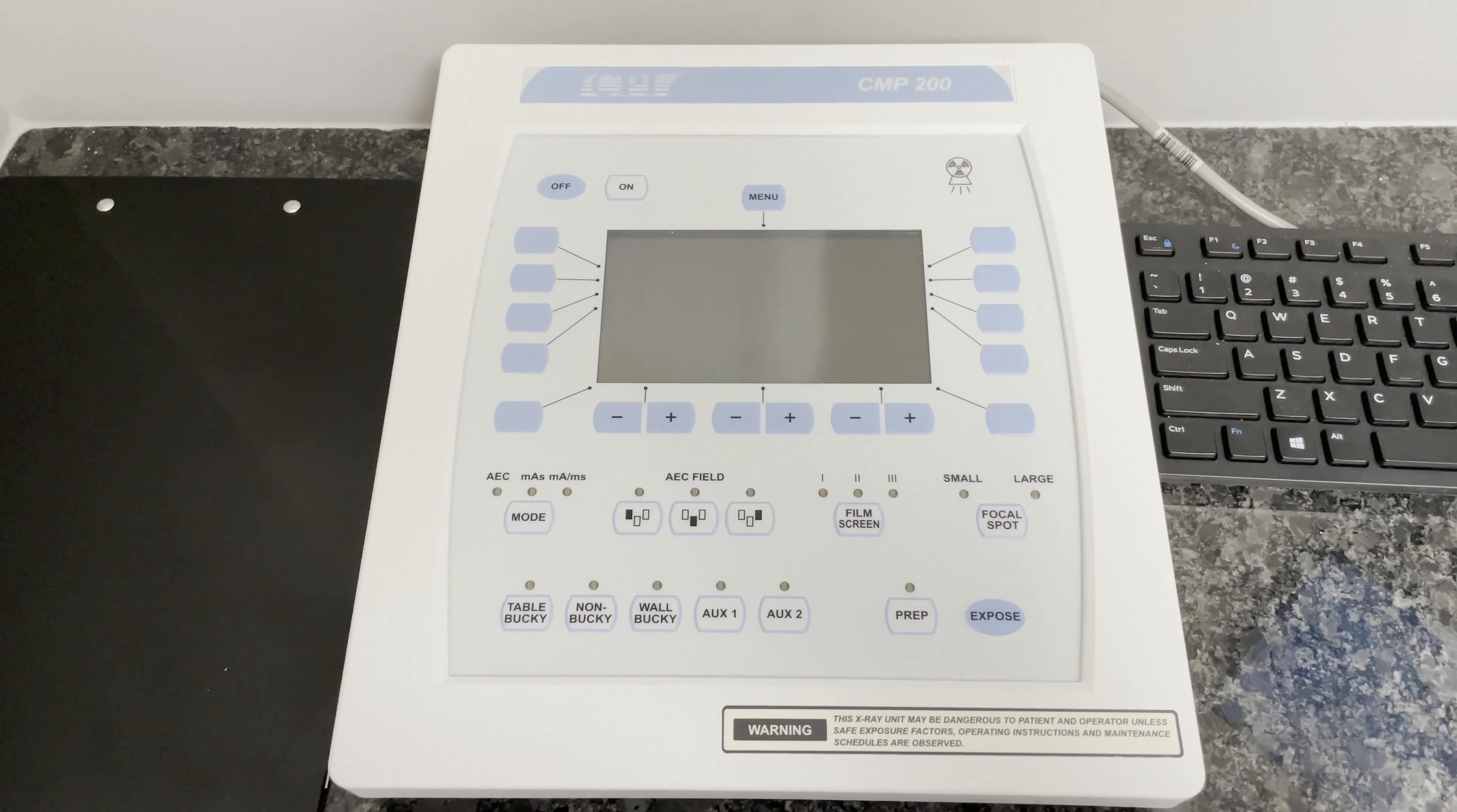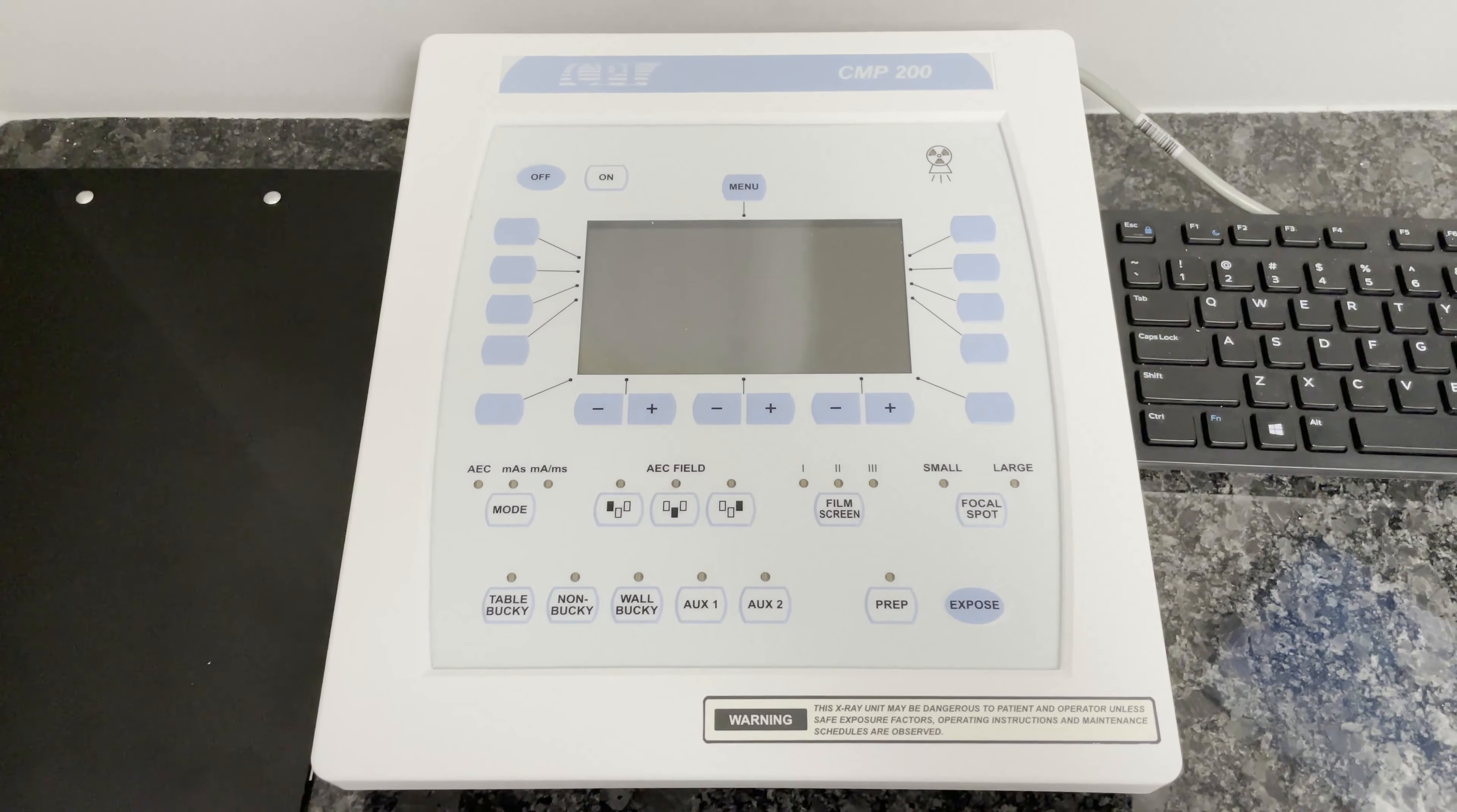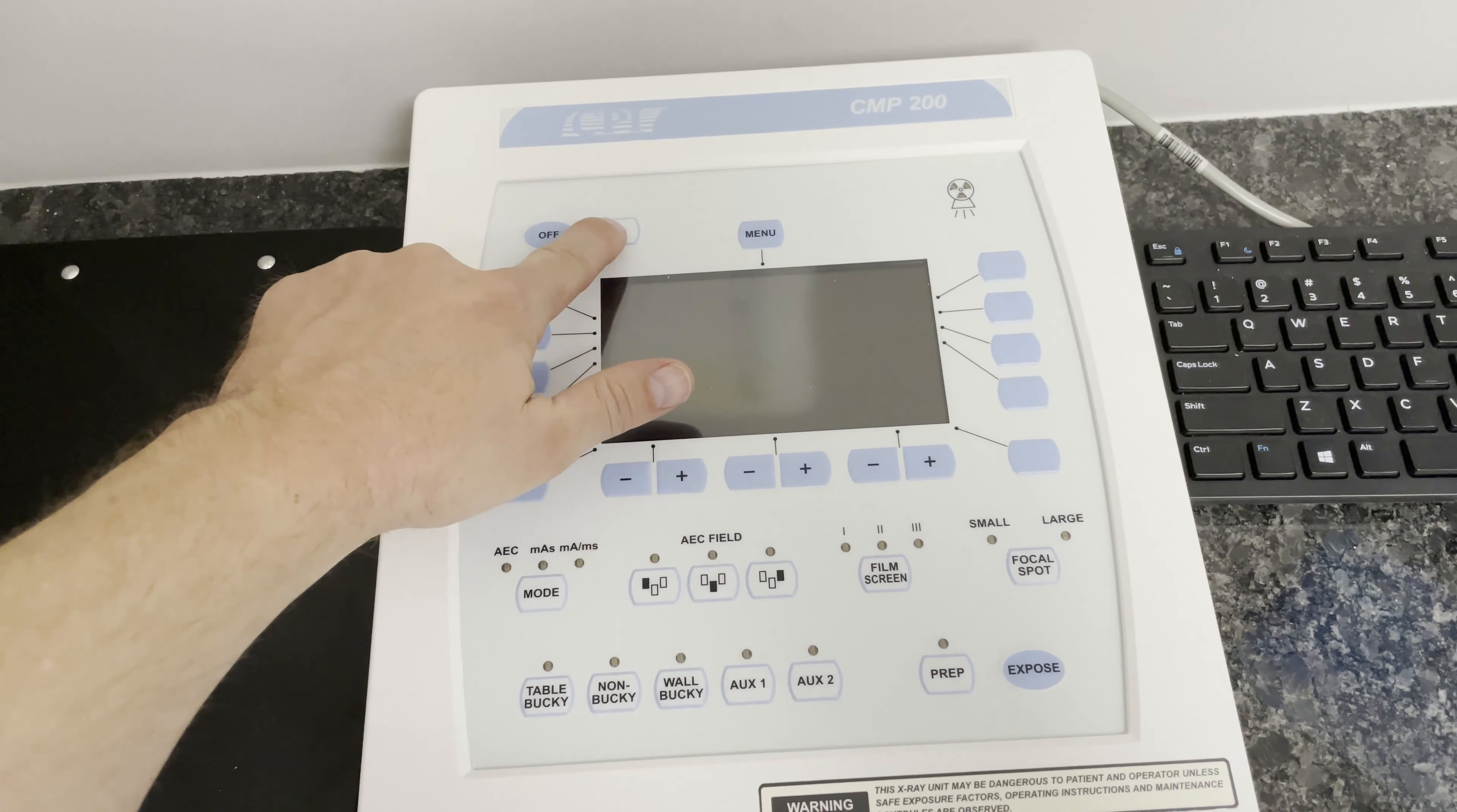This is the x-ray console for the CPI generator. To turn the CPI generator on, you click the on button.